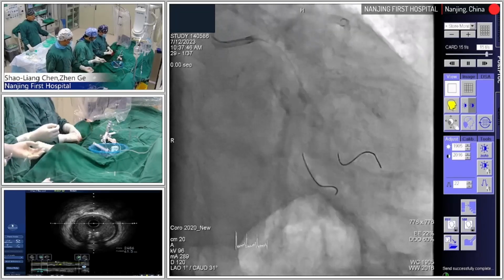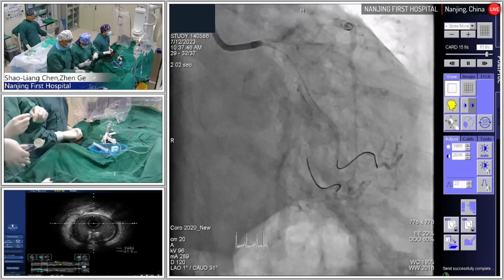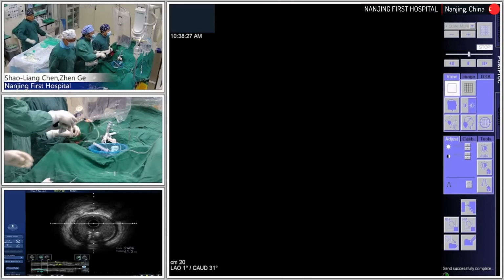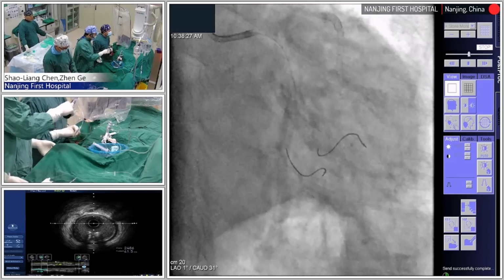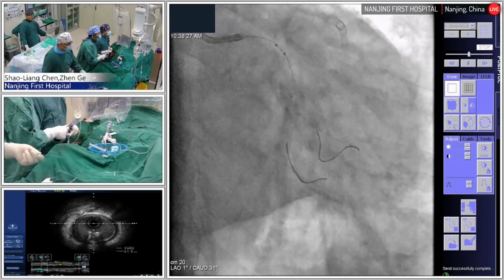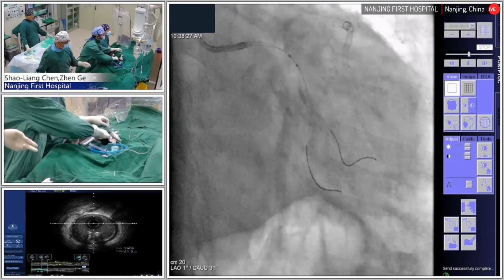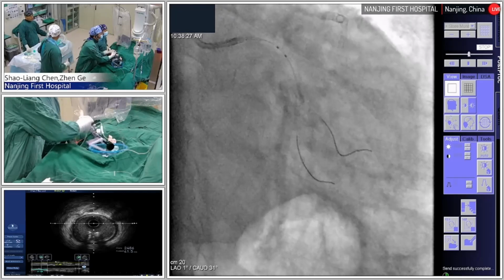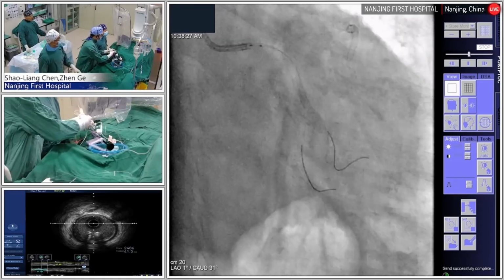Another trick is that for this patient you also need another stent for the proximal circumflex. Before that, if you did not do post dilation for the first stent, it would be very difficult in some cases to get two stents overlapping each other. They use another non-compliant balloon.